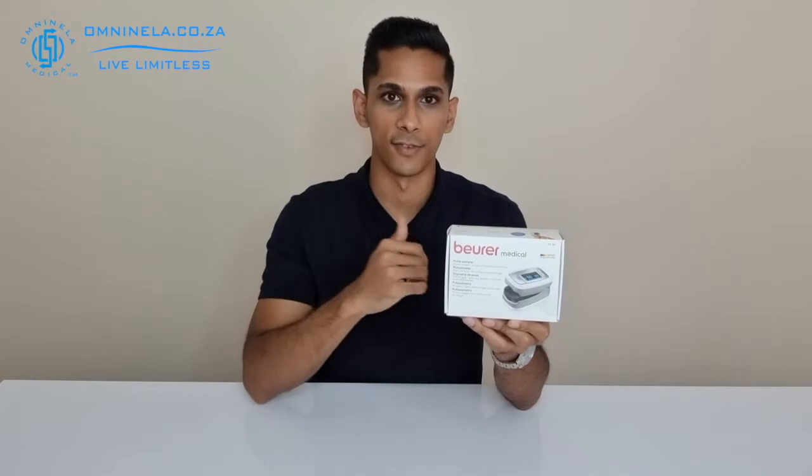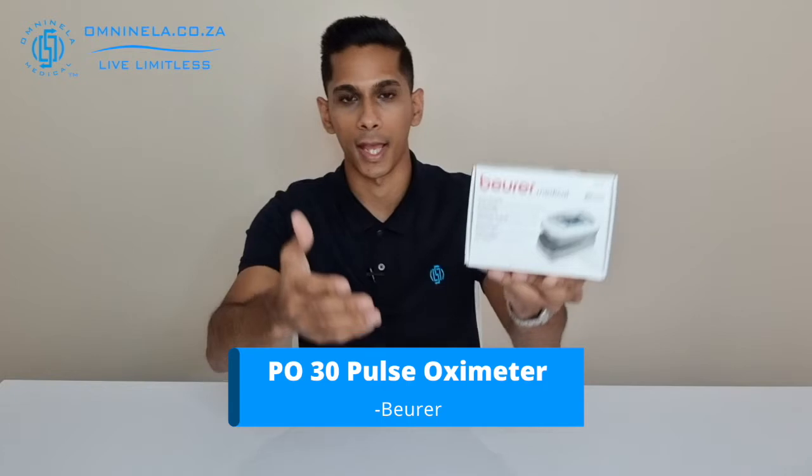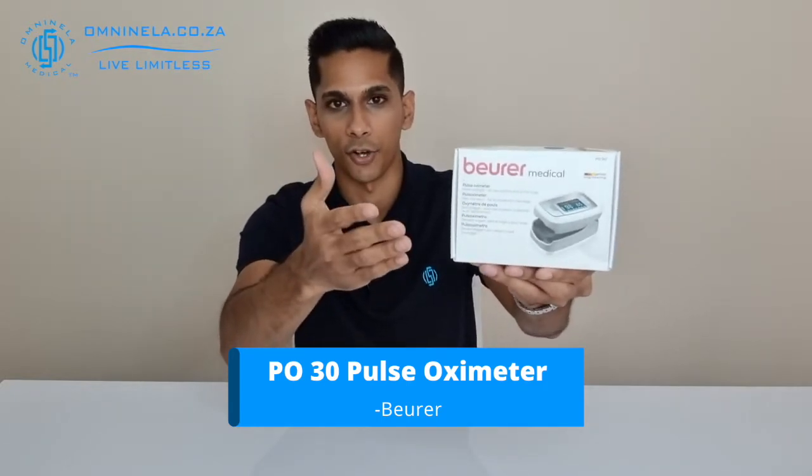If you have been recommended by your doctor to monitor your pulse oxygen levels and you have been looking for a device that would suit your needs, then today's video may be able to help you out. Today we're going to do an unboxing of the PO 30, and this is an entry level pulse oximeter from Boira.